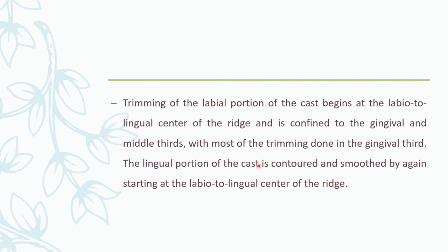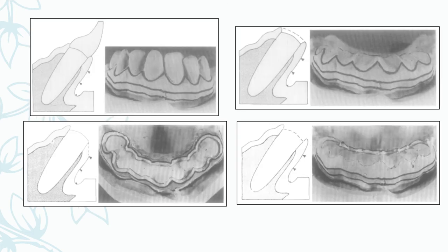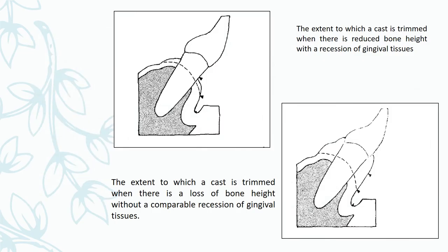Trimming the labial portion of the cast begins from the labio-lingual center of the ridge and is confined to the gingival and middle third. The lingual portion of the cast is contoured, smoothened, and again trimmed starting at the labio-lingual center. Photos show the guide for how to trim: starting from the region and trimming a little, appreciating the photos and smoothening out the concavity. This step is important because we are creating an edentulous space on the cast.